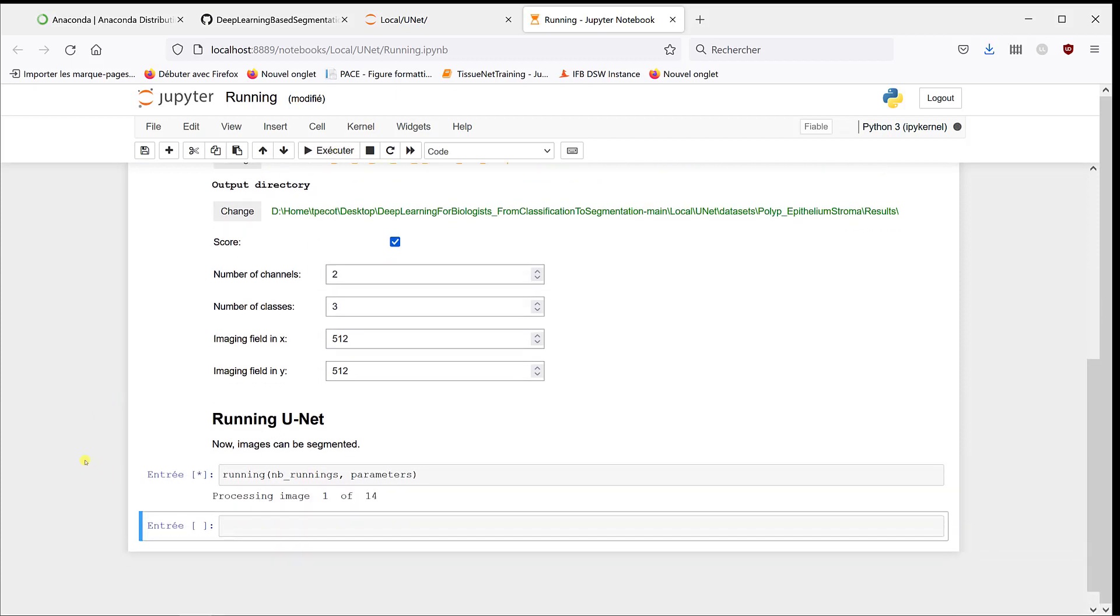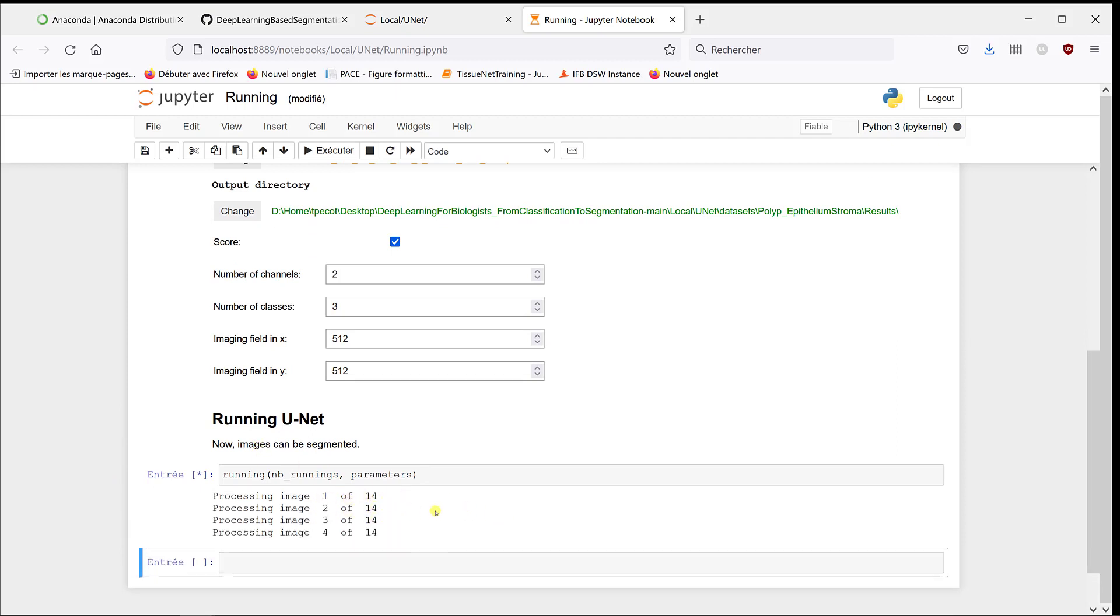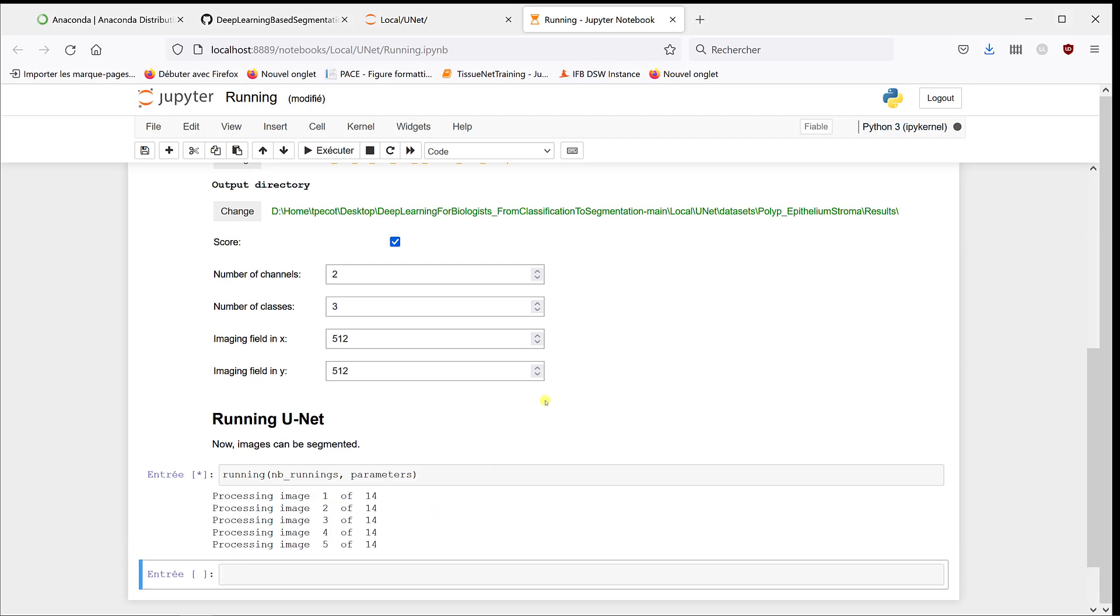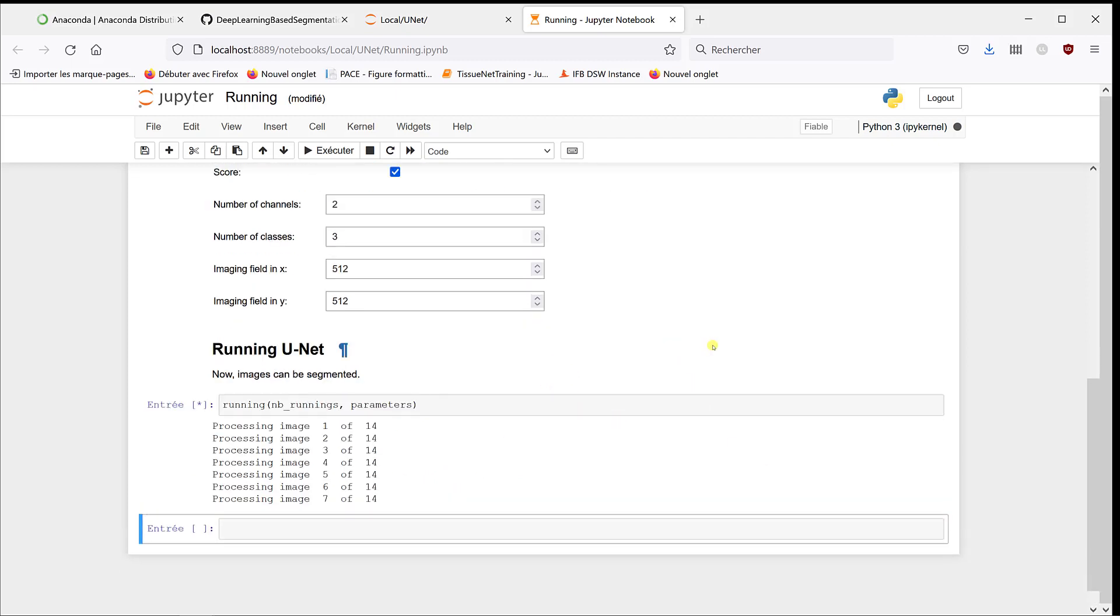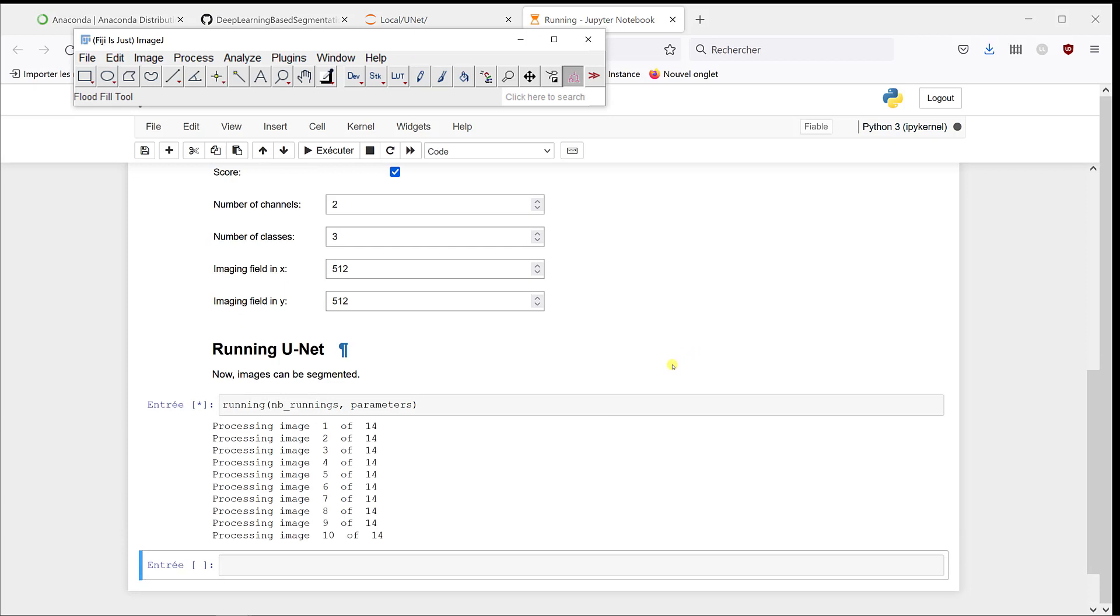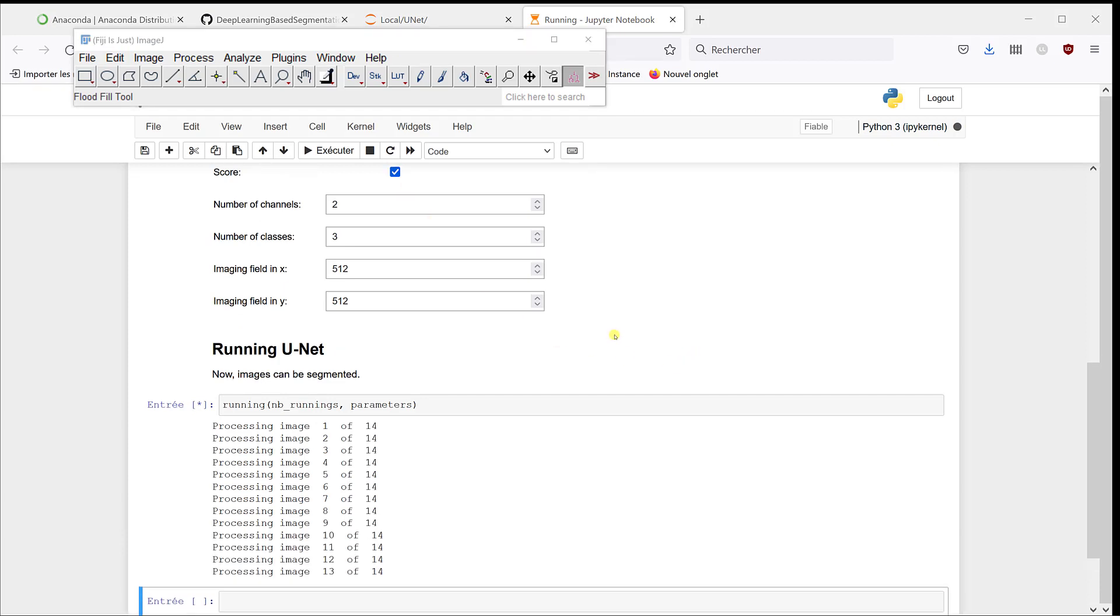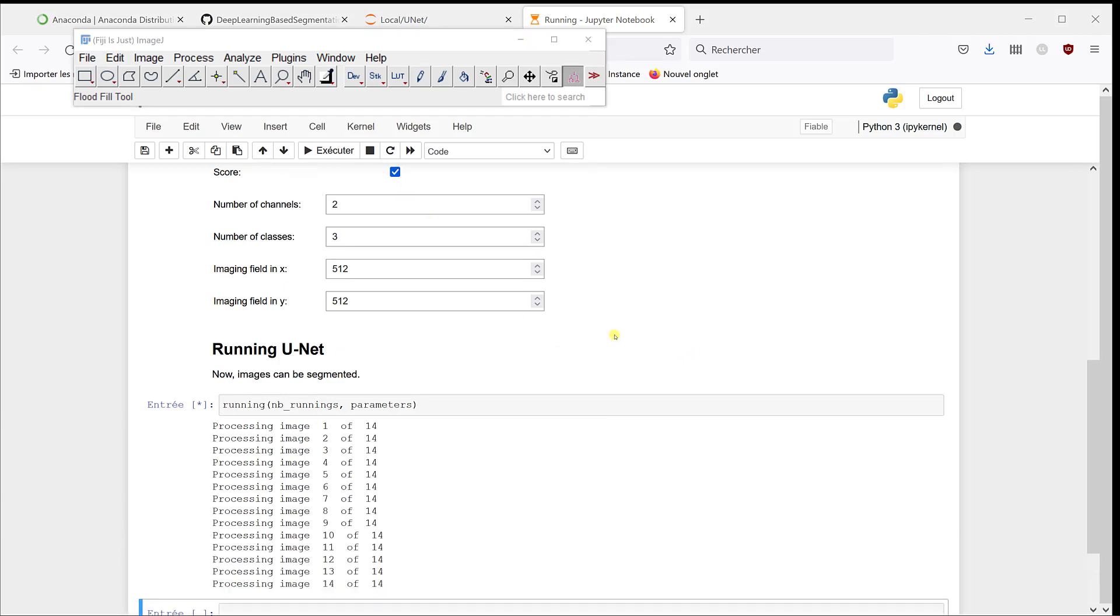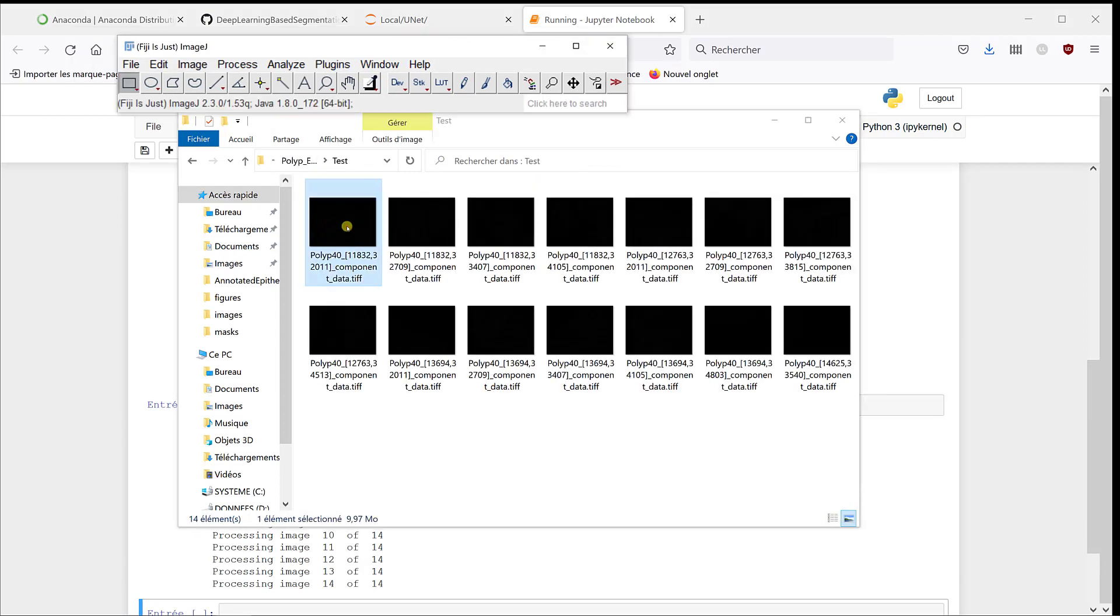So at the beginning, it tells you how many images you're going to process - so 14. The first time it takes a little bit of time because it needs to load the model, and then it goes pretty fast. And so we can have a look at the results. If I go back to my folder, let's have a look at the first image.